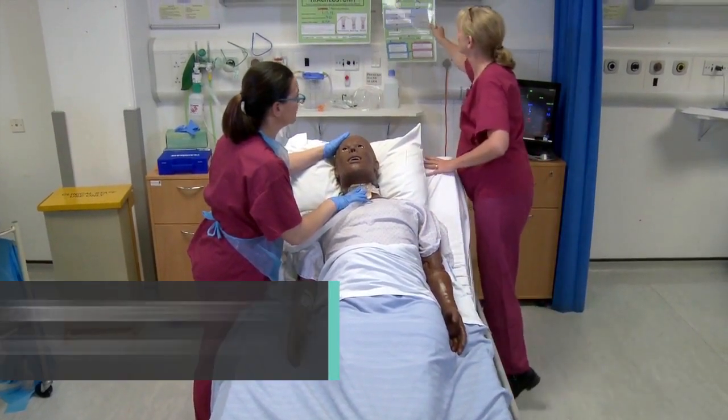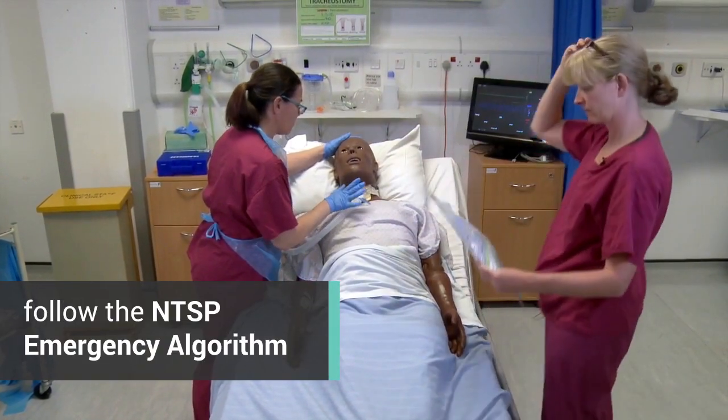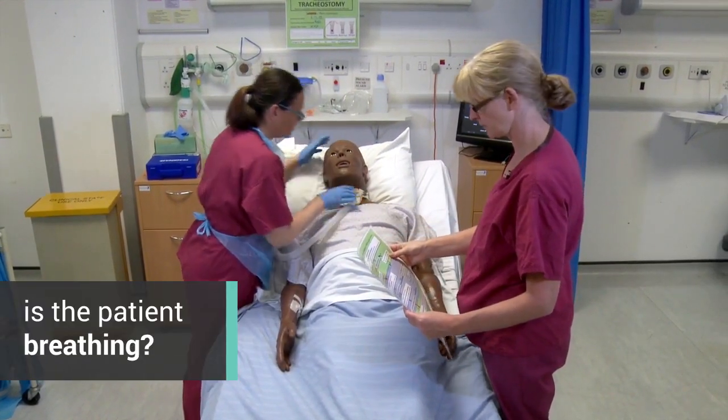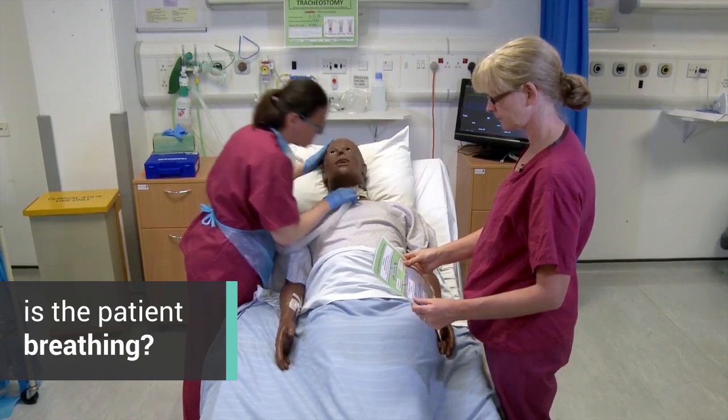He's really desaturated since we've put him back to bed. I don't know if we've dislodged the tube or we've just got lots of secretions here. Is he breathing? Well, I can feel air shifting through the trackie at the moment.